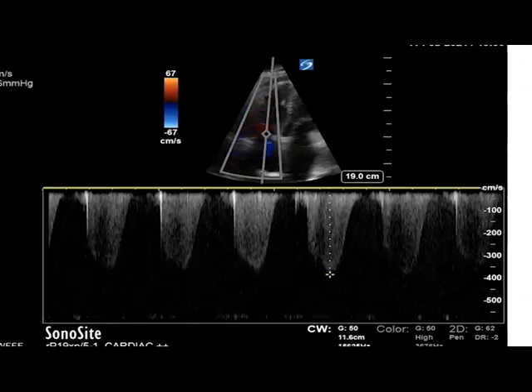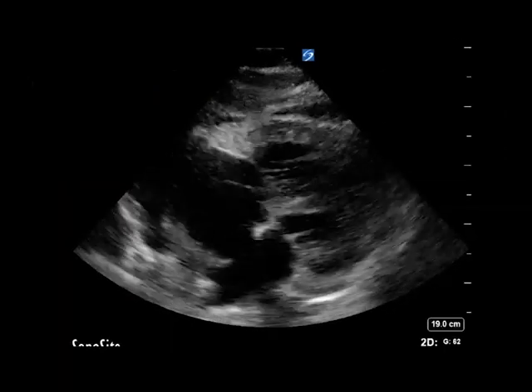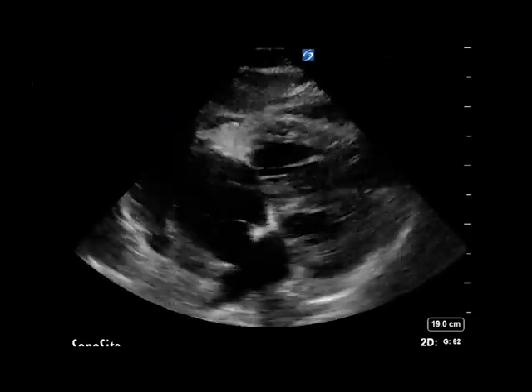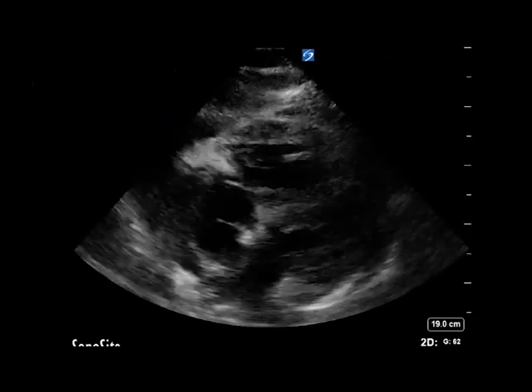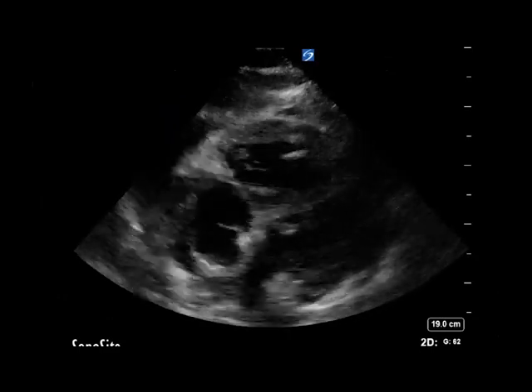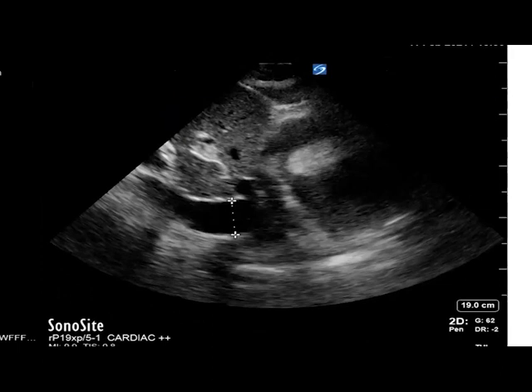The tricuspid regurgitation jet scale is up to 3.5 m/s — actually 3.8 m/s. Note how Hatim recorded that TR jet: he slid a little bit more anteriorly and used colour Doppler to find the perfect direction so his Doppler angle is absolutely in line with the jet. That's a really good example of off-axis imaging. In the subcostal view there's a big pericardial effusion with early signs of right atrial collapse — the RA is just starting to show early collapse, not the RV. The IVC is 2.6 cm without any collapse.